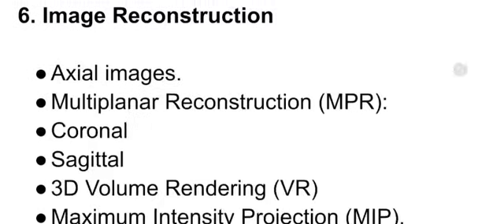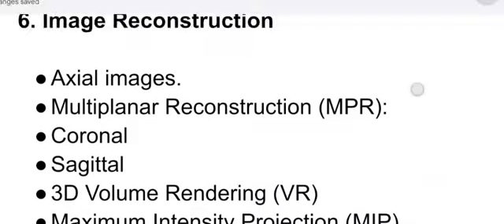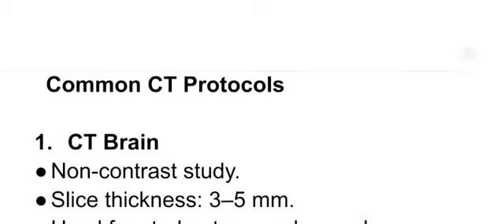Next is image reconstruction. Usually the images will be reconstructed as axial images, multiplanar reconstruction, coronal, sagittal, 3D volume rendering, and maximum intensity projection, that is MIP. These are the most common formats which we follow during image reconstruction.